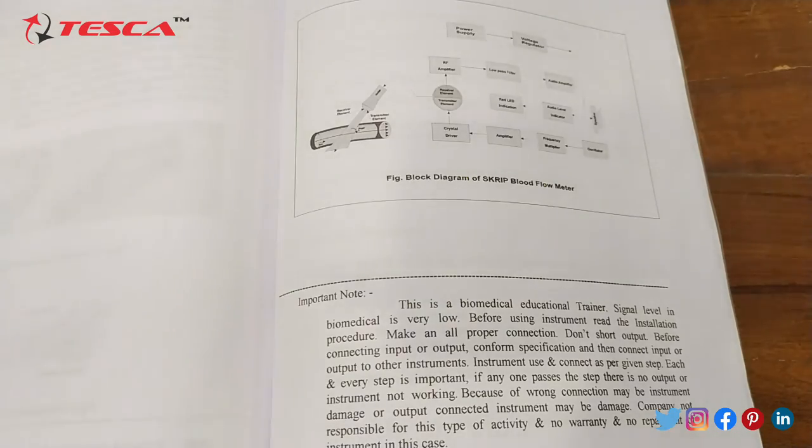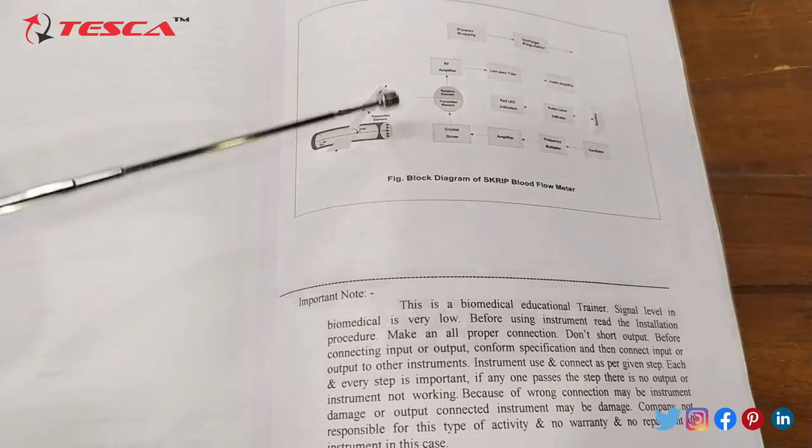Now let's see the block diagram. This is the block diagram of blood flow meter. You can see it on the manual also.